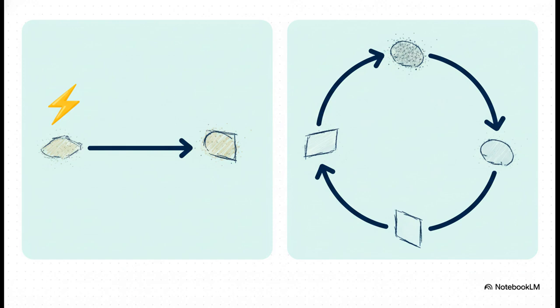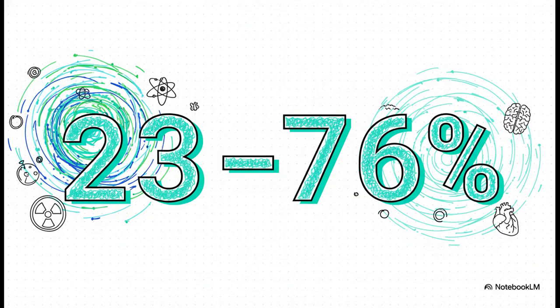And yeah, it's more computationally intensive, but its ability to produce clean, high-quality images from low-dose scans is nothing short of revolutionary. And the impact is just staggering. Clinical studies have shown that using iterative reconstruction allows for a reduction in patient radiation dose of anywhere from 23 to 76%, all while maintaining or even improving the diagnostic quality of the final image.